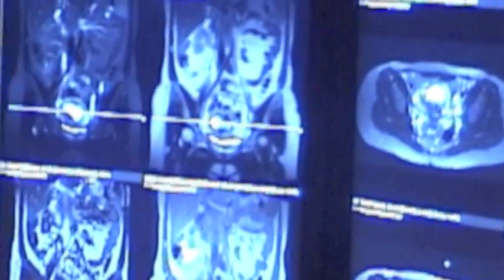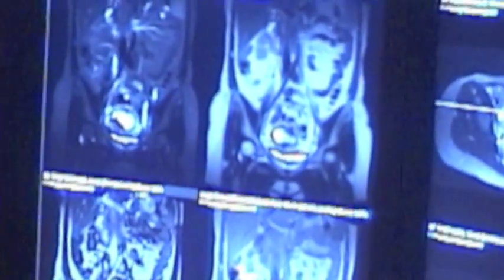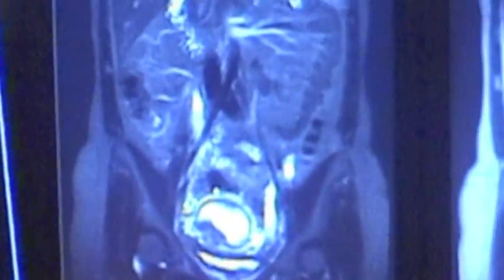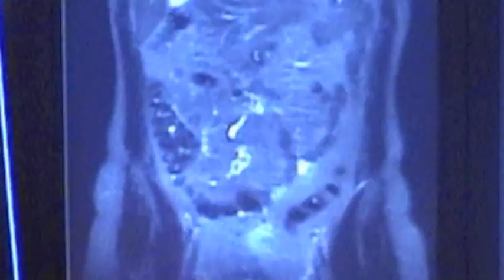Once I've set everything up manually, I begin by looking at the Haste IR series, double-clicking on it to make it a large field of view. I run through these very quickly, just front to back, and the goal is to find any bright fluid collection. Specifically, I look right around the cecum — which is here — it's always dark or mixed signal, and I look for bright fluid collection surrounding it.